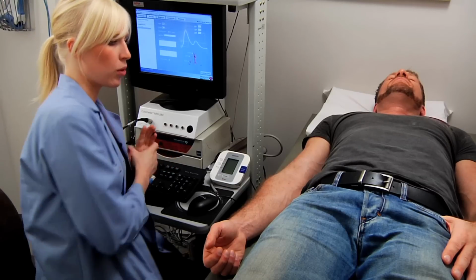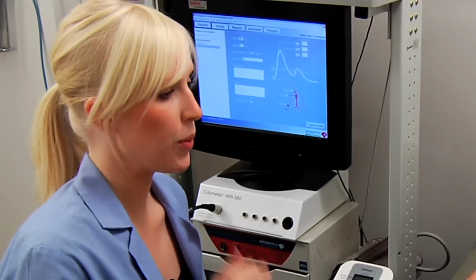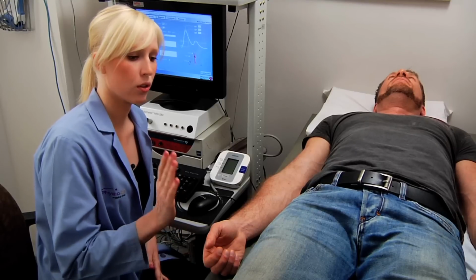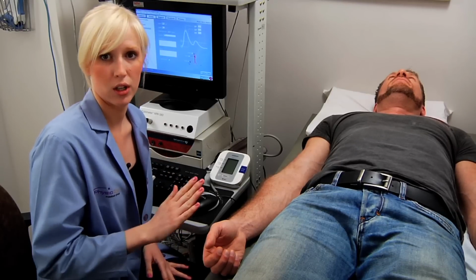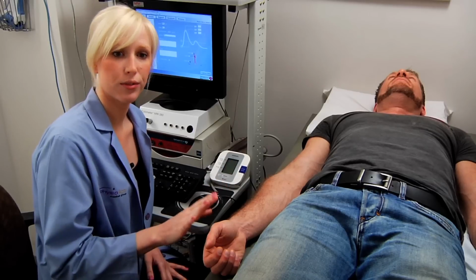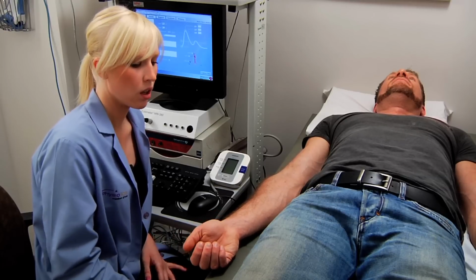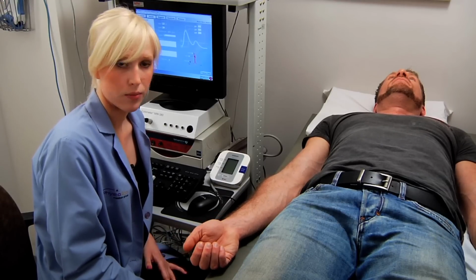Okay, so now I'm going to prepare my patient for this test. The patient positioning is important because you want the patient to be lying completely flat on their back, rested. Their legs have to be uncrossed for their entire resting period and during the test. So at this point, you'll tell the patient, okay, I'm going to have you lay flat, your palms facing up or facing the ceiling, and your legs are uncrossed.